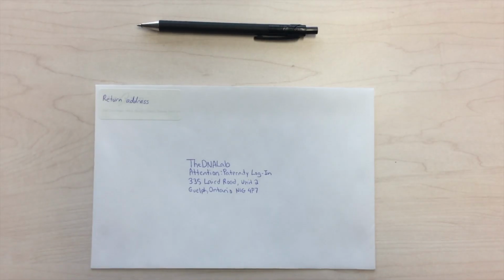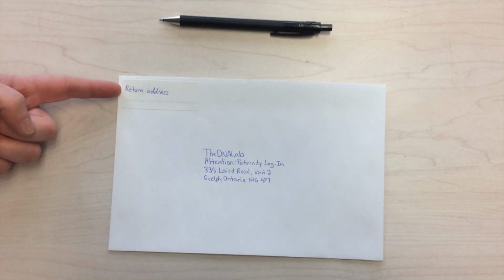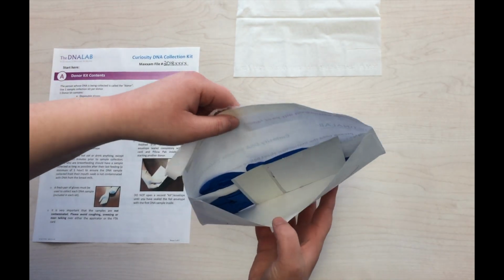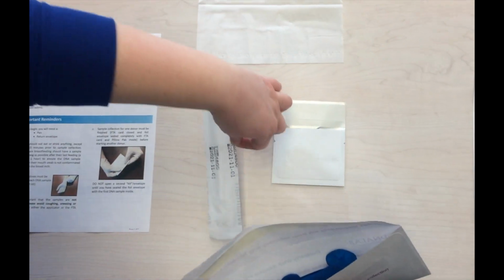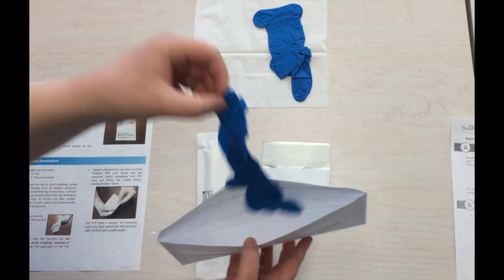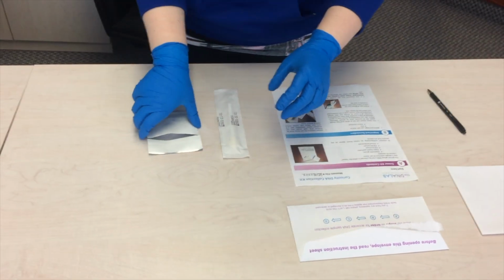and sealed. Before you begin, you will need a pen and an envelope labeled with the address of the DNA lab as well as your own address. The address of the DNA lab can be found on the instruction sheet provided with the kit. Each kit you receive will contain a foil pouch containing an FTA sample card and a pillow pack, a foam-tipped applicator otherwise known as a foam swab, and disposable gloves. The kit also contains the written version of these instructions with your personal file number written on the top right corner.